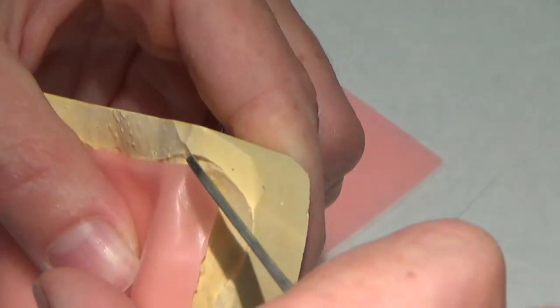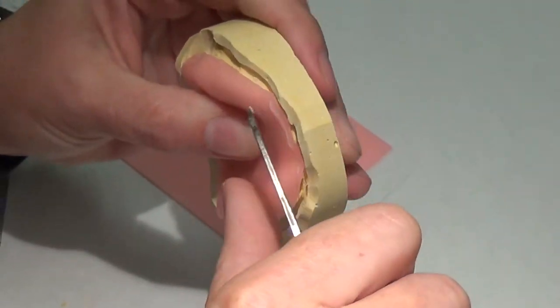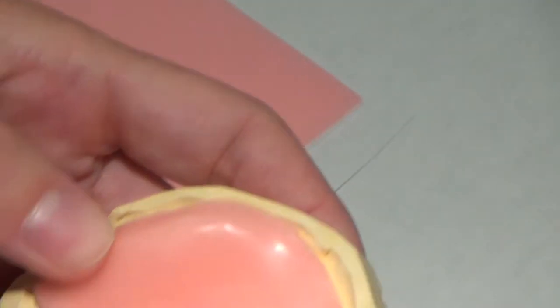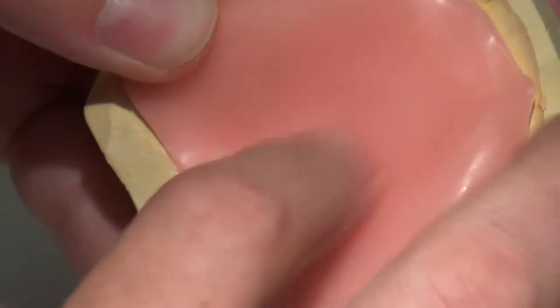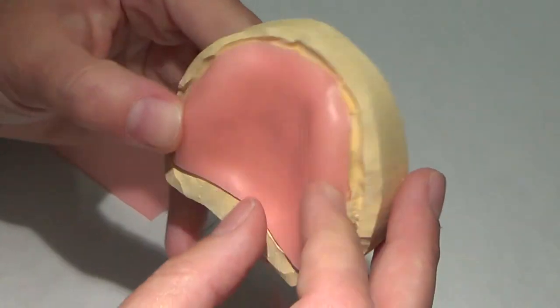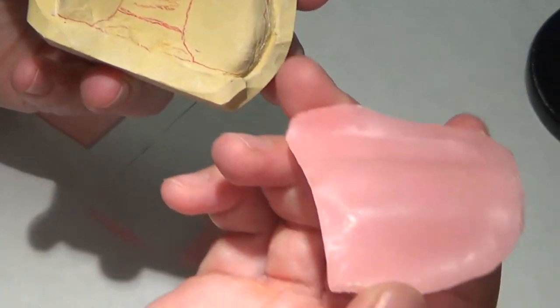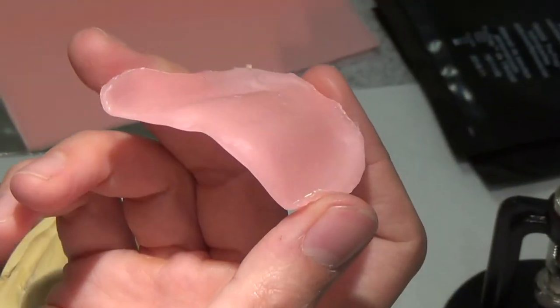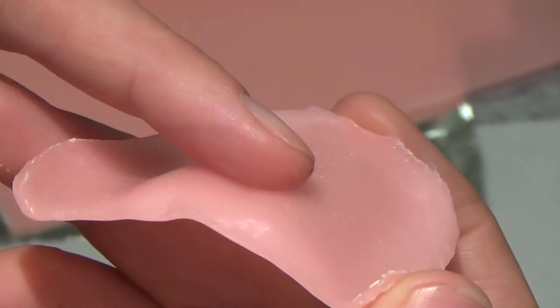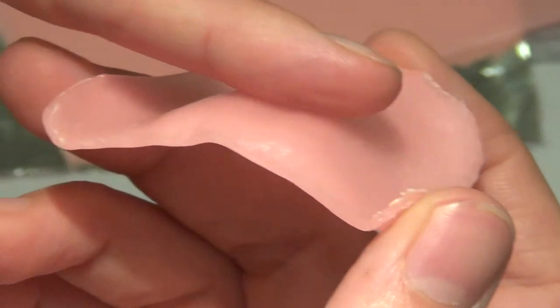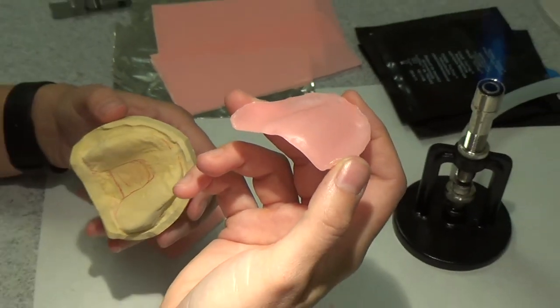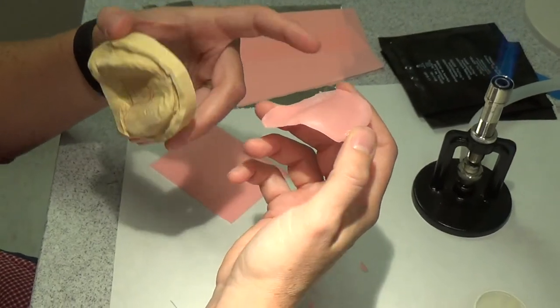I'm going to do a little bit more trimming. You can do this two ways. You can trim a lot ahead of time or you can trim after the fact. But what I want you to notice is how smooth this wax is. It's well adapted to the cast. You can see it's not very retentive. Let's look at what the contours of her denture are going to look like. It's very short. Her palate is just as deep as her vestibule. It's almost equal, which means it's kind of just like a flat plate.